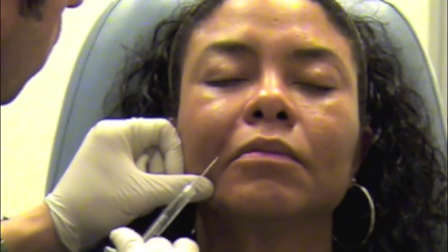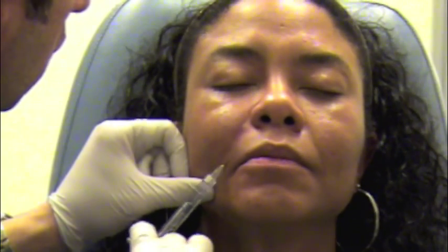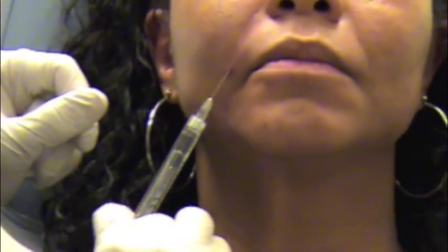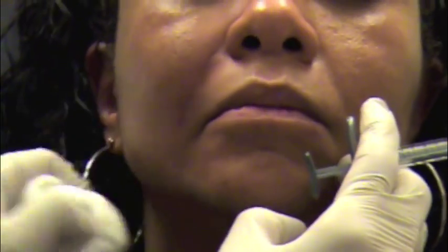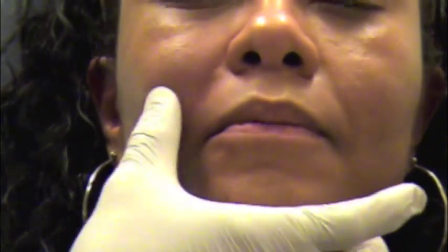I also feel you have some scar tissue under here as I'm giving you this material. I think you've had some injections probably before, and they cause some scarring in the area. Yes, usually. All right. So you can see that the area has drastically improved. I'm doing serial layers, cross-hatching, building an architecture of hyaluronic in that area, and basically right before your eye you can see an improvement here. All right.